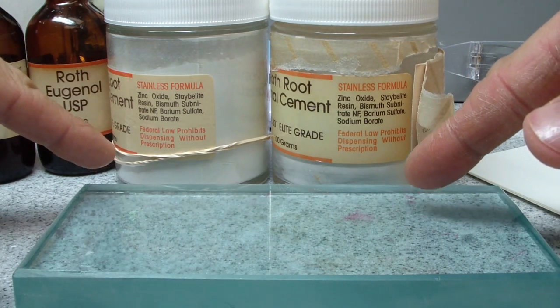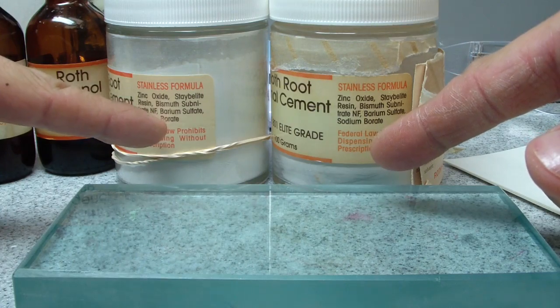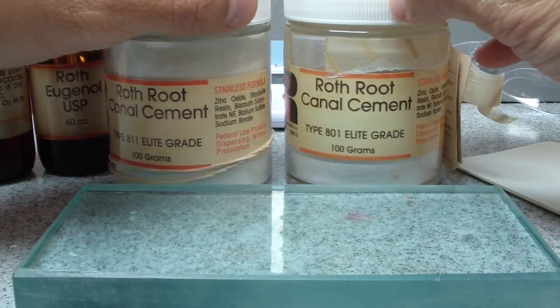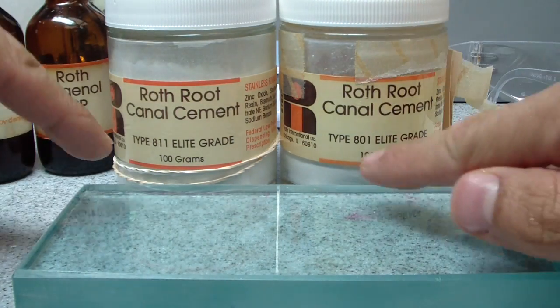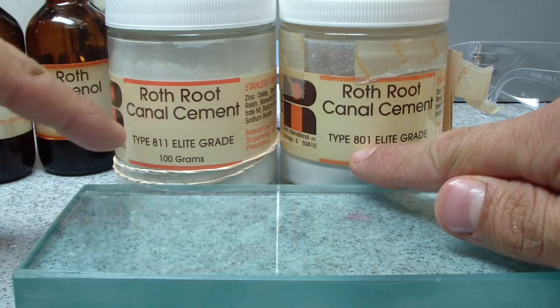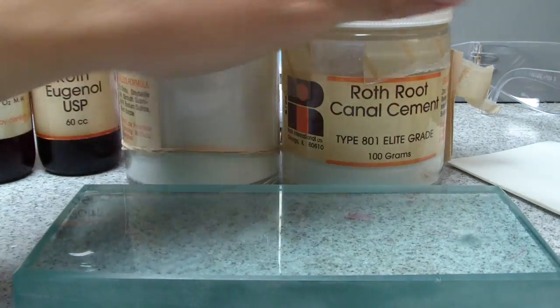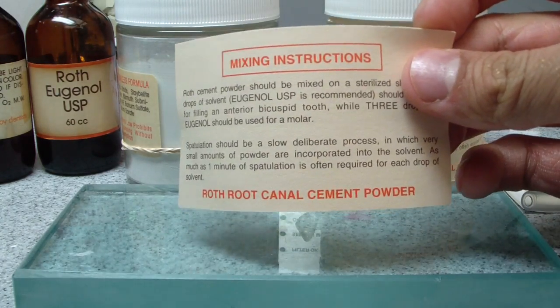Zinc oxide, stabilite resin, bismuth sub-nitrate NF, barium sulfate, sodium borate. Apparently the only difference in these two products according to the label is that there's a zero here and there's a one here. In any event, the neat thing is that until I took the tape off, I found the instructions.